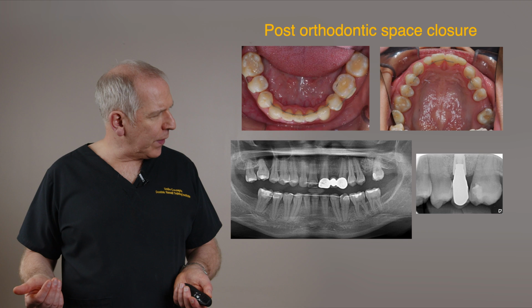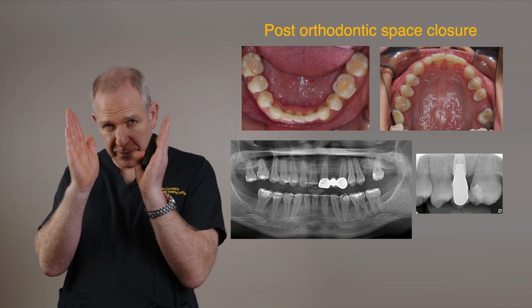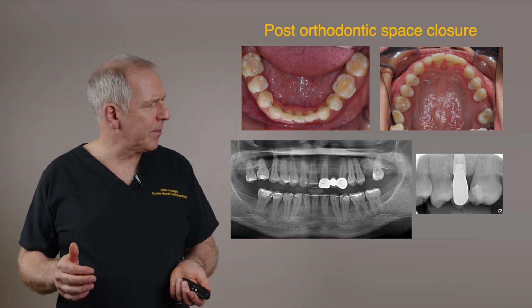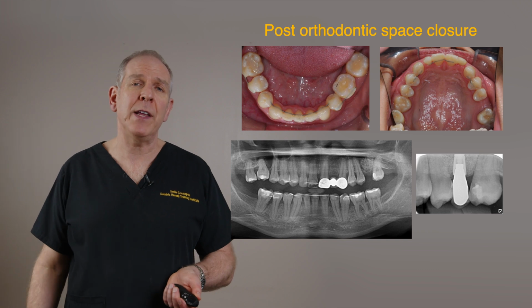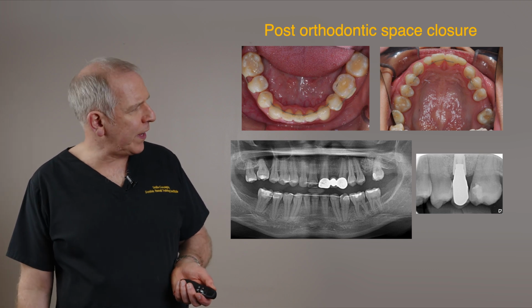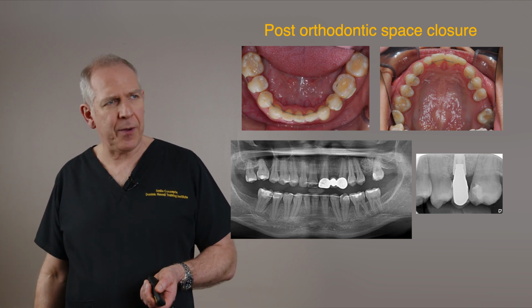And then finally on the left side, you can see that the orthodontist has left the roots very nicely for us for implant treatment. However, by the time we got to this stage, the patient had run out of money for implants. So what you'll see here is we actually went for an adhesive bridge in this area.